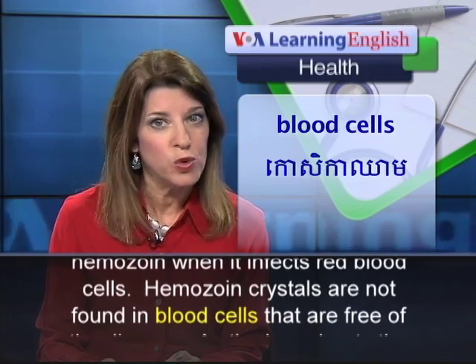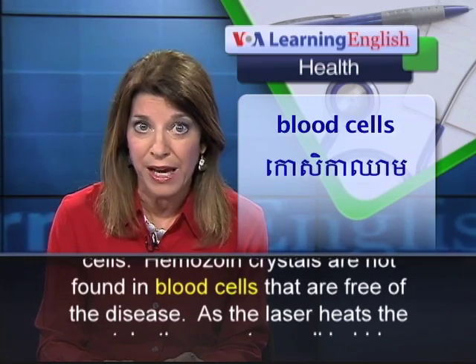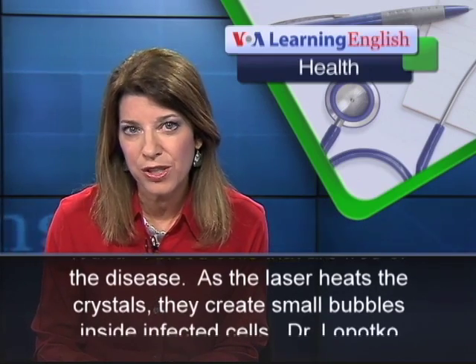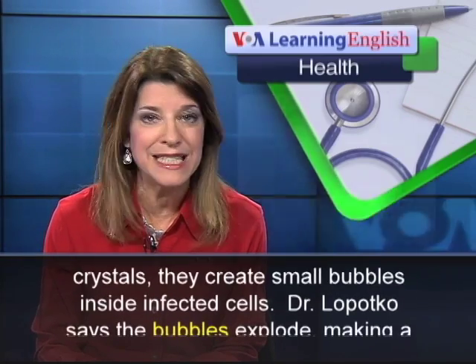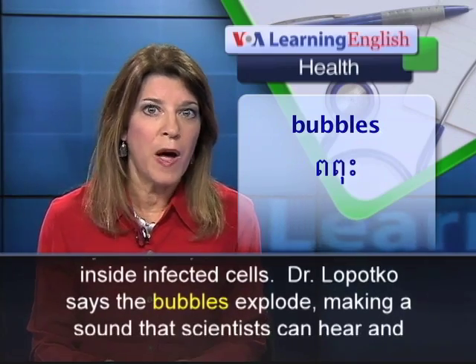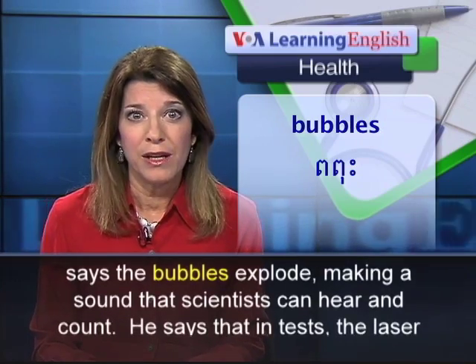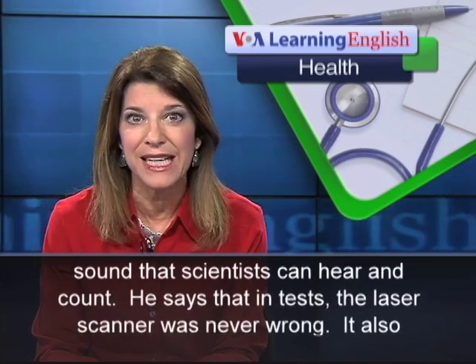Hemozoin crystals are not found in blood cells that are free of the disease. As the laser heats the crystals, they create small bubbles inside infected cells. Dr. Lopotko says the bubbles explode, making a sound that scientists can hear and count.